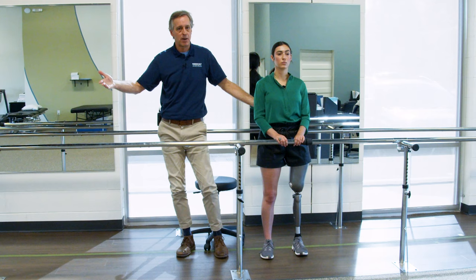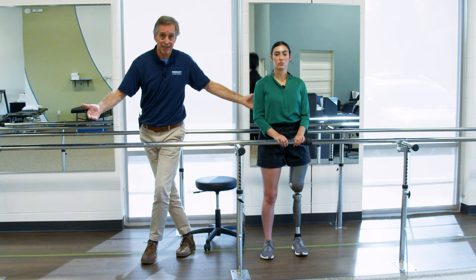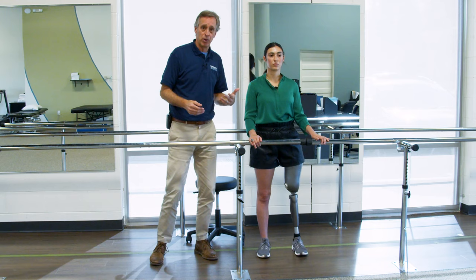The only way to recover is to put my left foot over my right and then come back to neutral. That's my stumble recovery. And stumbles are going to happen. Falls are what we want to prevent, right? So if you lose your balance, it's stumble recovery to get myself back to neutral.